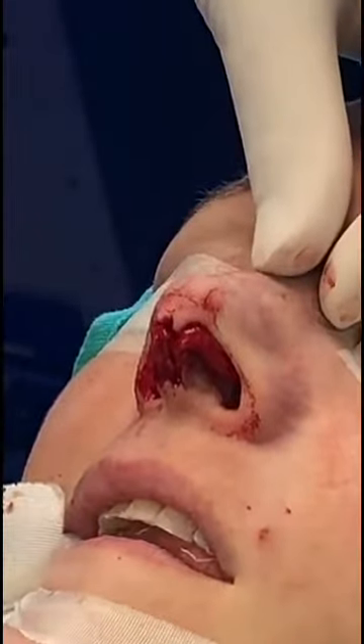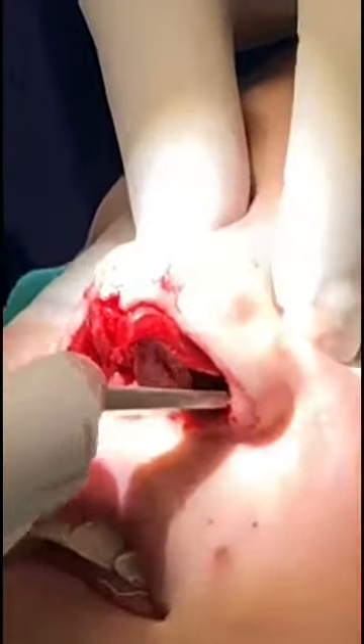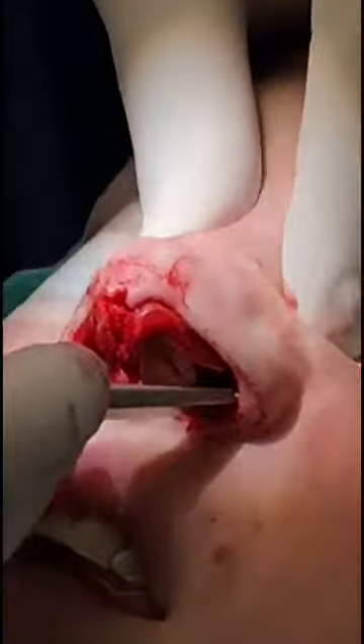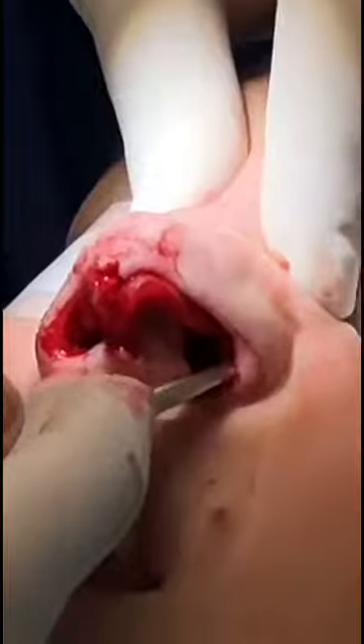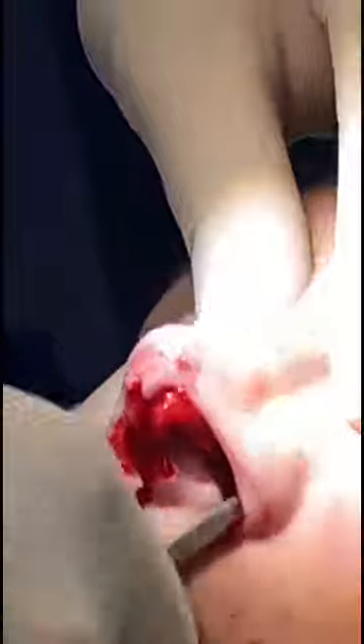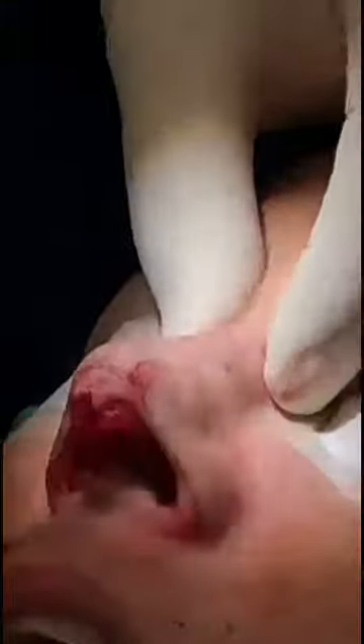Now we'll do a lateral osteotomy. We're doing a lateral osteotomy on the left side. We shift it over, and now you can see the bones are much more in the midline than they were before.